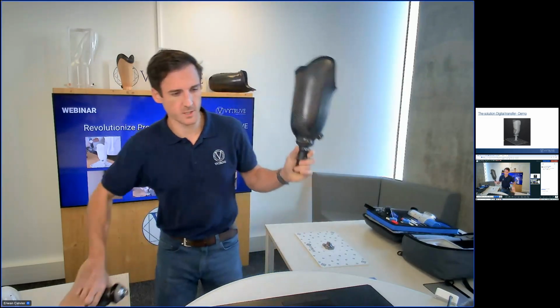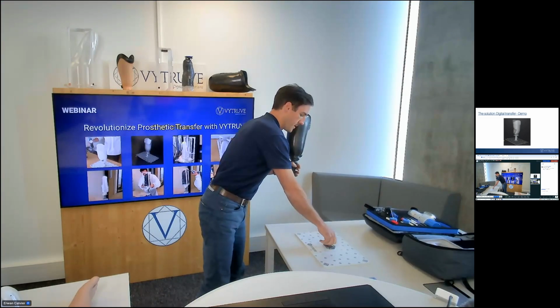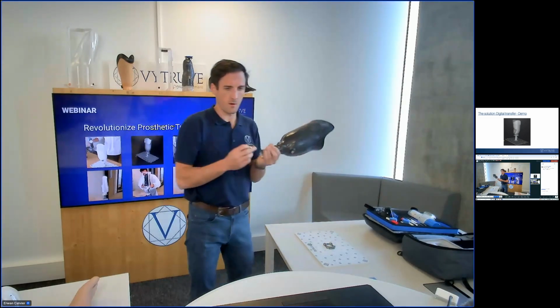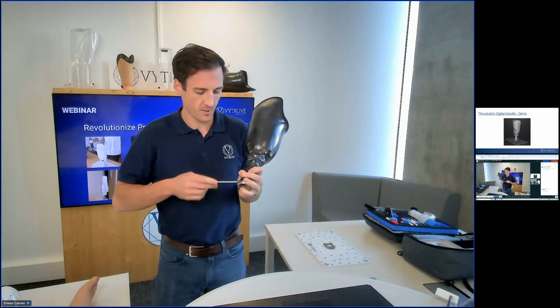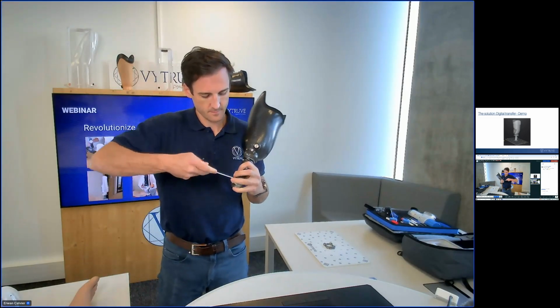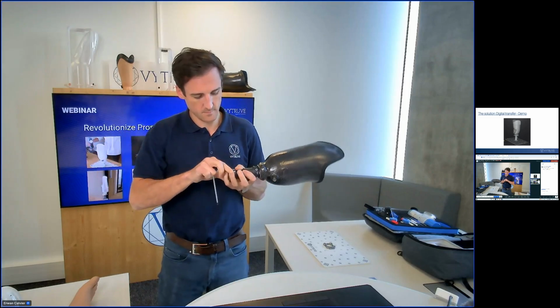And I will position this on the V pyramid of my V transfer. So, like this.